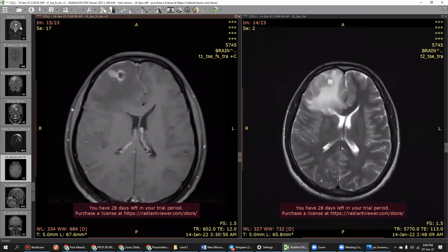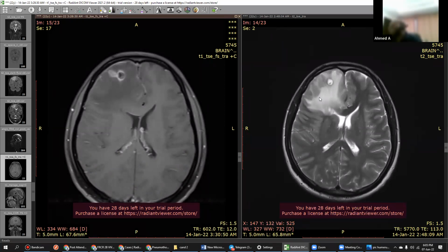Okay. Nice case. And any other case? Sorry, Dr. Aejaz, what can be the differential which we can offer in this? Tuberculosis? What she has told. Yes, tuberculosis, metastasis, and all. But after telling all those three things, metastasis, abscess also is a fine thing. After telling all those things, then you should say.